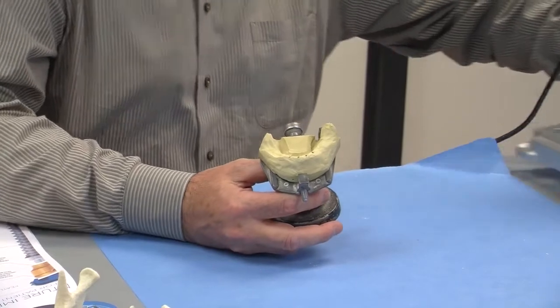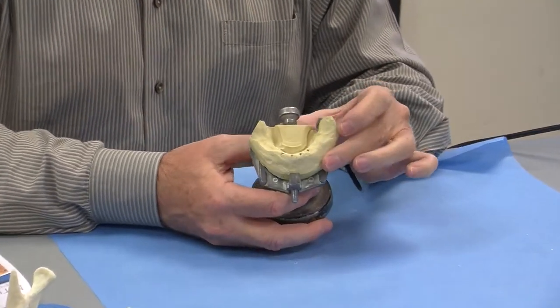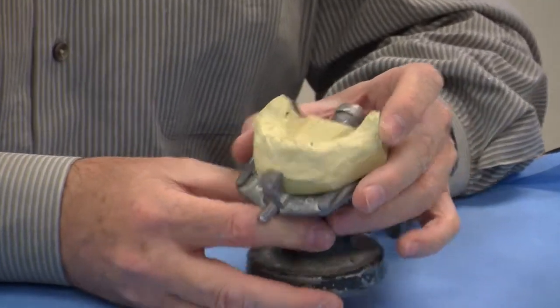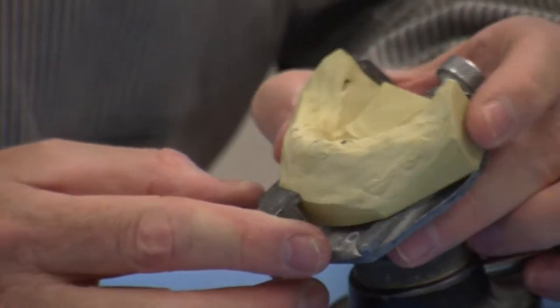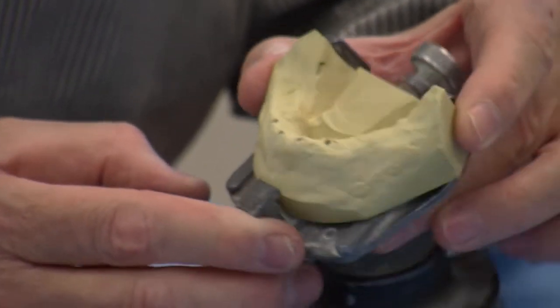Now we finish with the press drill, and you can see that we have 4 strictly parallel holes, 2 millimeter diameter holes, in the exact direction of the jaw.